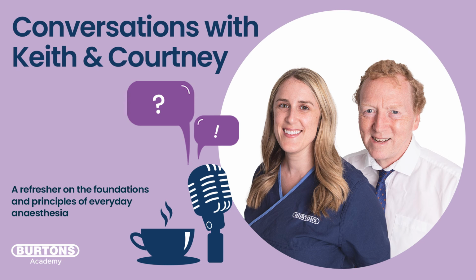So if we have our waveform that's just telling us that there's CO2 somewhere in the breath, we don't actually know if they're rebreathing that in, or maybe they've stopped breathing, if they've finished their exhalation and the sensor's just picking up what's left sitting around in that sample port. So can you give anyone a little bit of a taster on what color-coded capnography is that we could perhaps talk about in another episode?